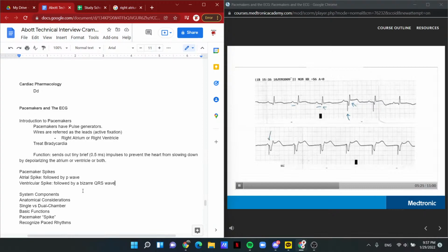Now down here you notice the pacemaker spike is occurring even earlier, so the P wave hasn't really had a chance to conduct down the AV node, and what you have here is a fully paced QRS complex. It's wide, it's bizarre, and then you've got these secondary T wave abnormalities. So that's what we have for this bottom strip. Now notice the P waves disappear. So this pacemaker is not really paying attention to the P waves.